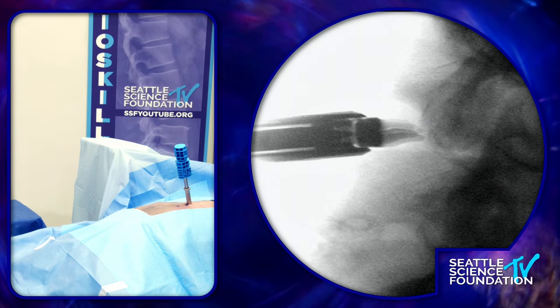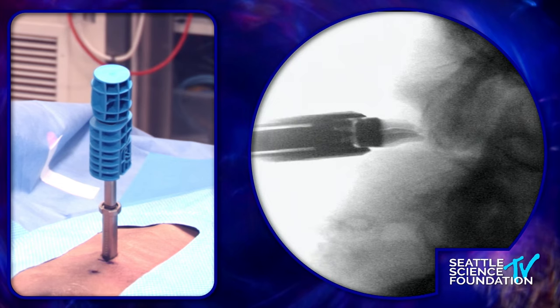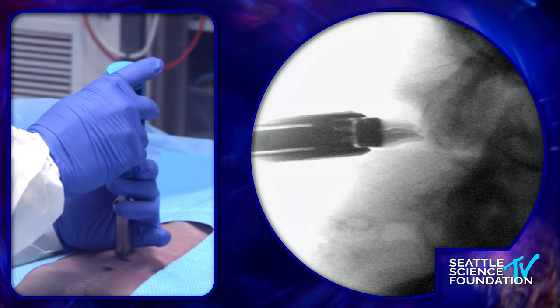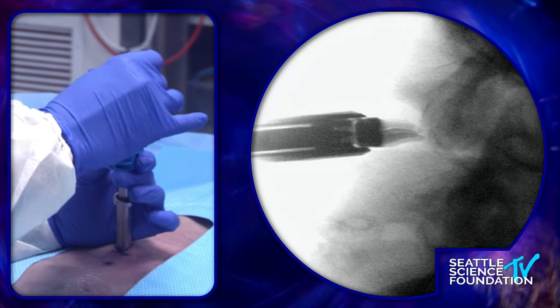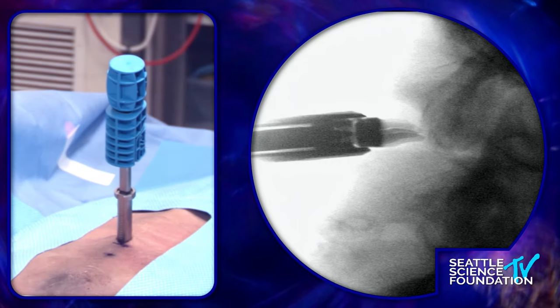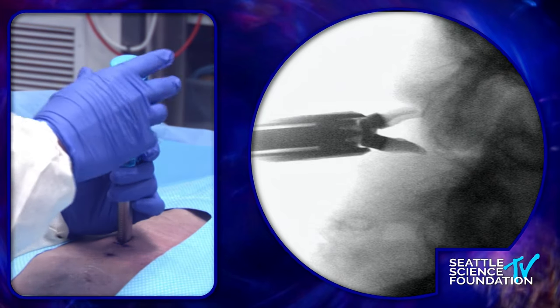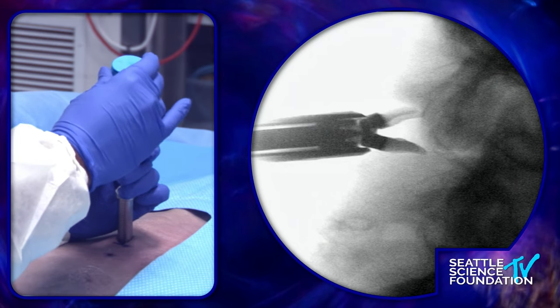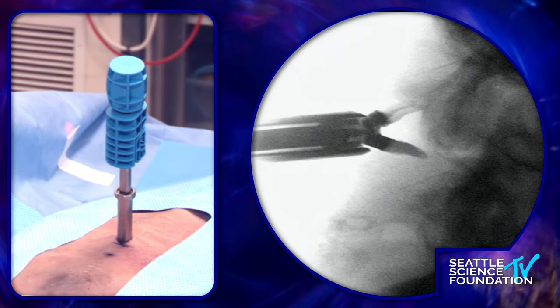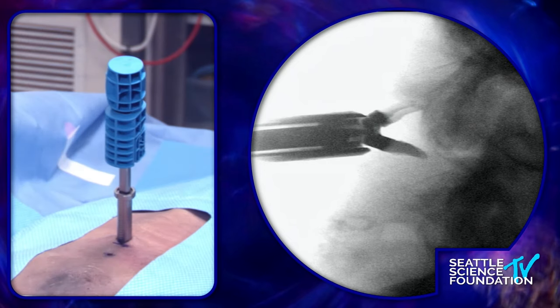Teresa just gave me a 12-millimeter Superion — that's the purple one; they come in candy colors. When you drop it in, you can see the beak of the Superion. I want to make sure the tips are not past the spinal laminar line. If I deploy anterior to that spinal laminar line, I'll get caught on the lamina, and the last thing we want is for this to propel itself into the spinal canal. I'm right at the edge but happy, so I'm going to start to deploy this. I'm just using three fingers — not a lot of force — going until I feel resistance.